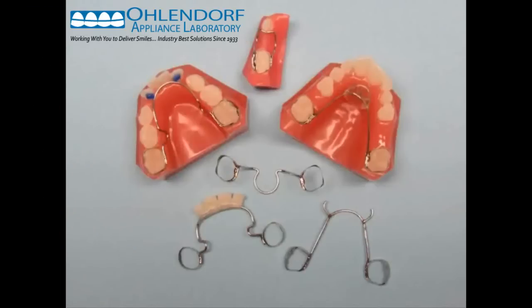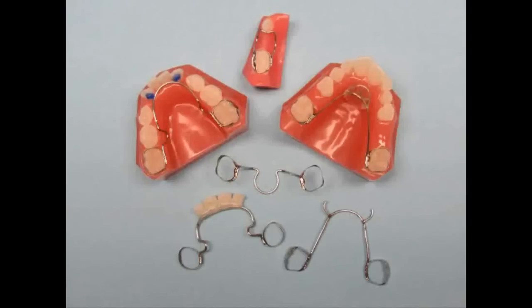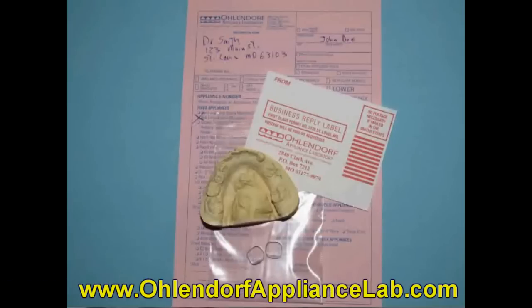As you can see, there are many variations to even the simplest of space maintainers. If you're using a variation of one of these appliances that is different than what I have shown, please let us know. We can fabricate these appliances any way you want us to. We will keep your specific instructions on file so you get your appliances fabricated the way you want them every time you send us a case. In order to send us a case for a space maintainer, we will need a working model or PVS impression of the arch. We normally don't need an opposing model unless you're getting a Groper appliance. One big question we always get is about sending in bands.